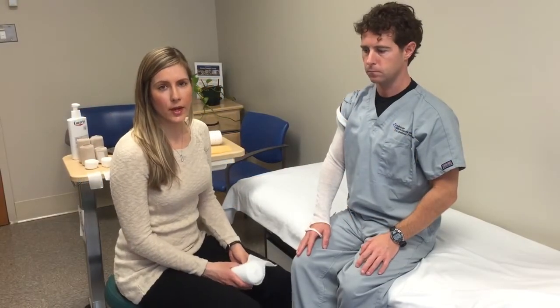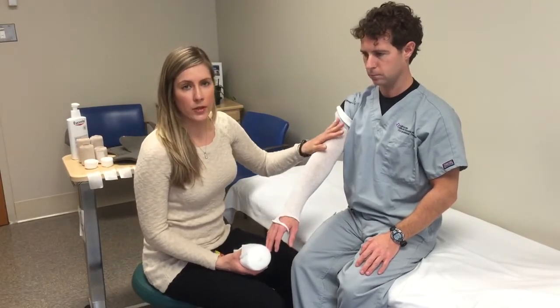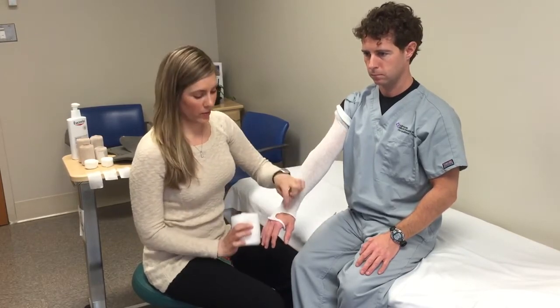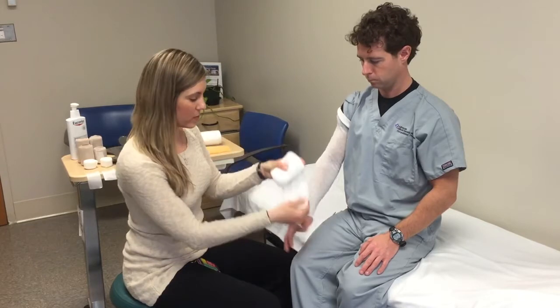In this video we're reviewing how to wrap an arm affected with lymphedema. We've already put on a good layer of lotion to the arm and hand to protect the skin from dryness, and we've put on a stockinette with a hole cut out for the thumb. First thing we'll do is apply our fluffy padding to protect bony areas.